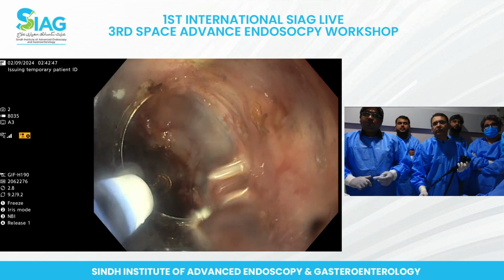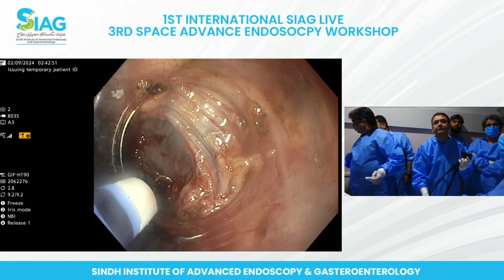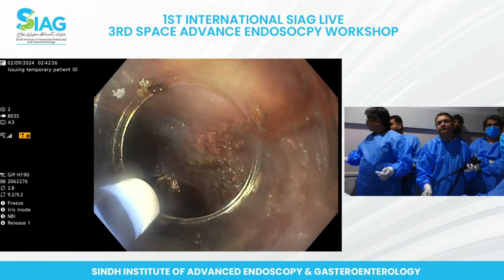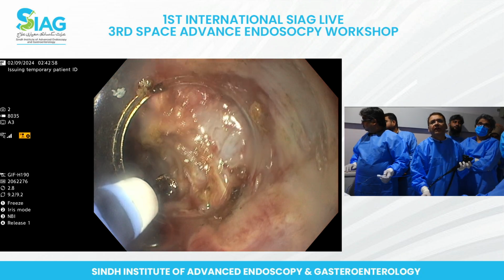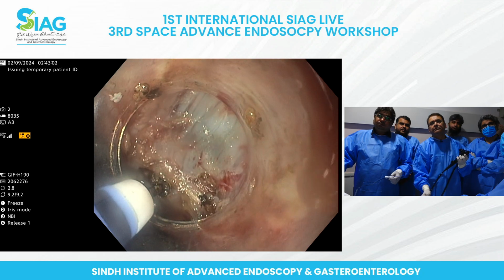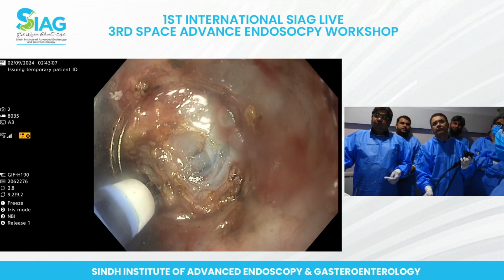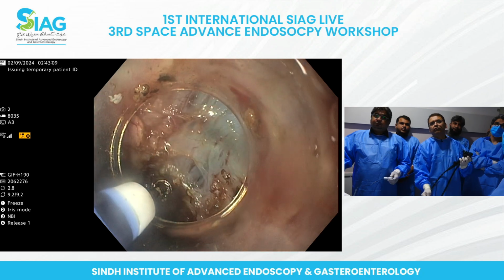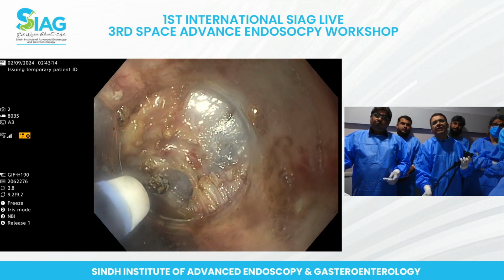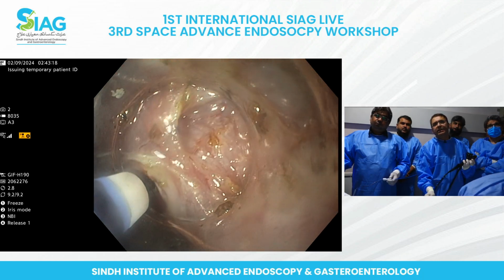Give me a dry cut. Ready? Okay, go back. So yeah, that's a longitudinal outside. You see. I don't know if you are noticing one thing. I'm hooking up a little bit of muscle at the bottom and just pulling it up.